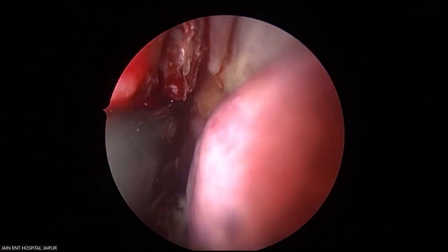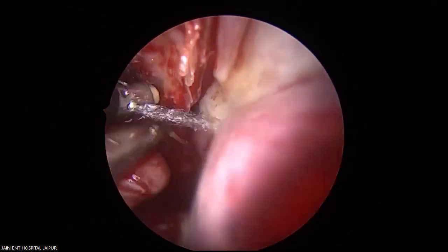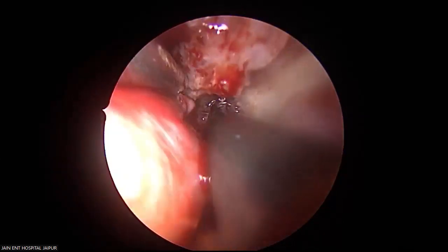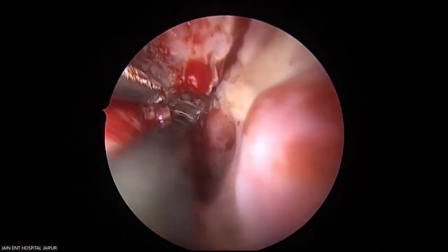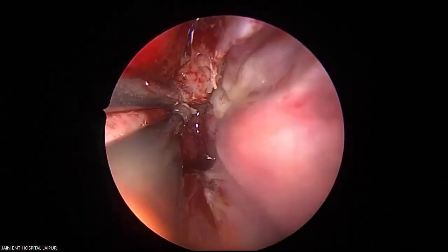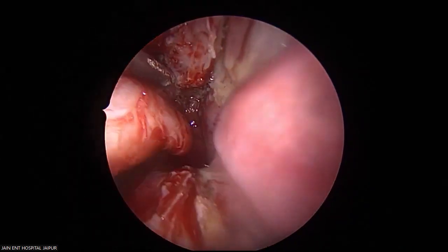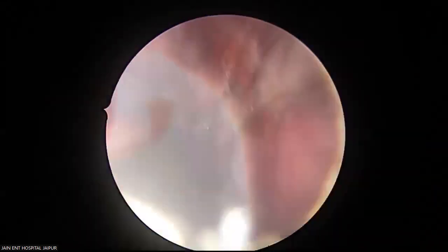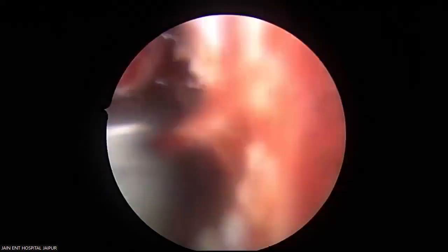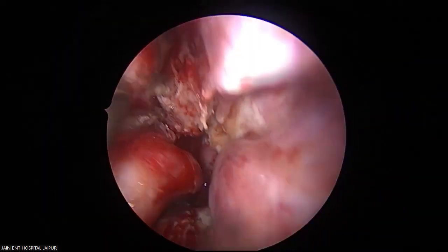See posteriorly everywhere. What I have ensured, the nasopharyngeal roof periosteum. See this? This is the key which invites the blood supply from the opposite side, which I have completely coagulated. Ensure there is no source of bleeding from the opposite side. Okay?